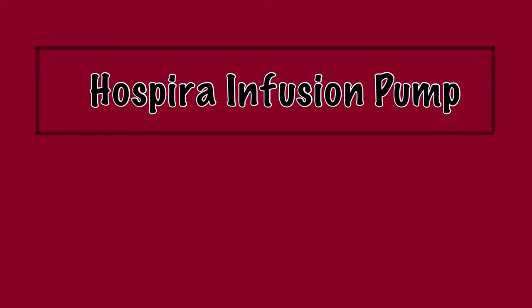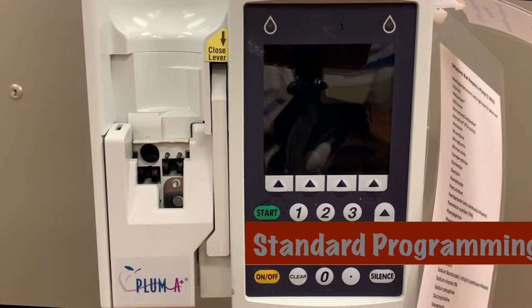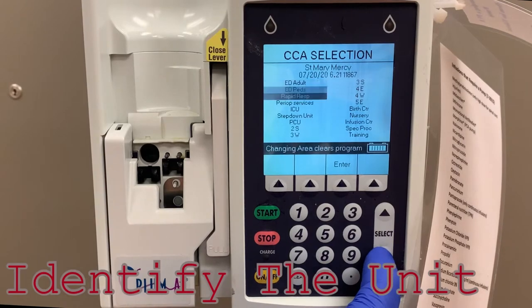In this video, we will look at the Hospira Plum A-plus infusion pump and how to program different infusions. When using an infusion pump, you will always start with programming the primary or A-line. Begin by powering on the infusion pump by pressing the on-off button in the lower left-hand corner. The first screen lists all of the units in the hospital. Identify the unit on which you are working and press enter.